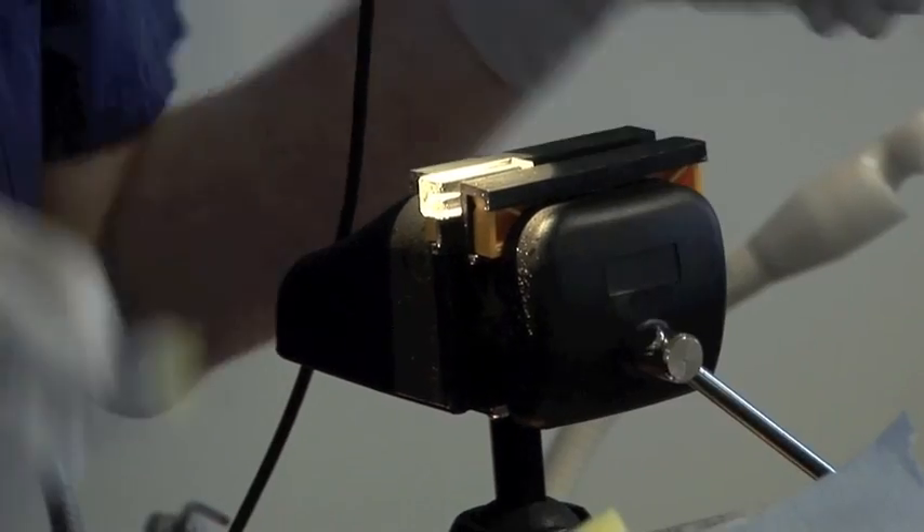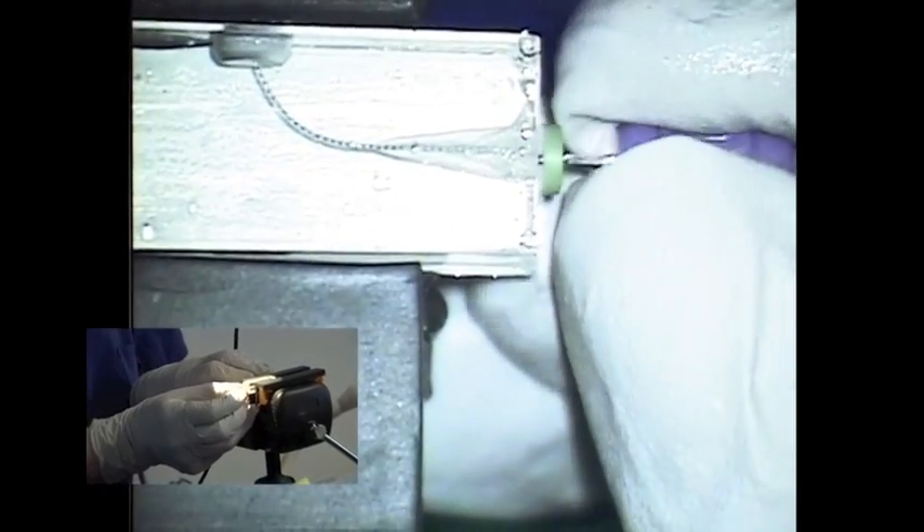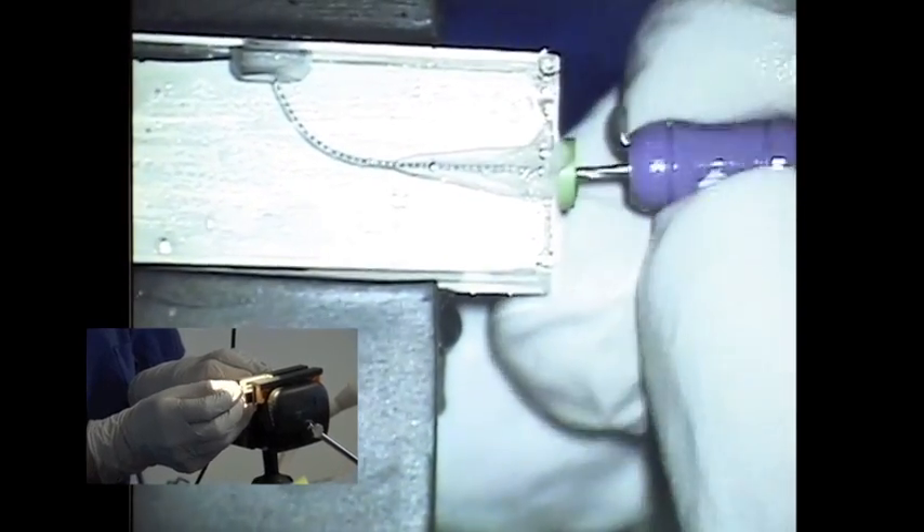In between every single file you use, you must irrigate with hypochlorite, and do it until the debris runs clear. Place the size 10 in again — it's really important to use the correct motion: it's a watch winding motion backwards and forwards. Just watch-wind backwards and forwards until you get a little bit of apical resistance, make a little cut, and come out. It's a very, very light force, as you can see with my fingers.